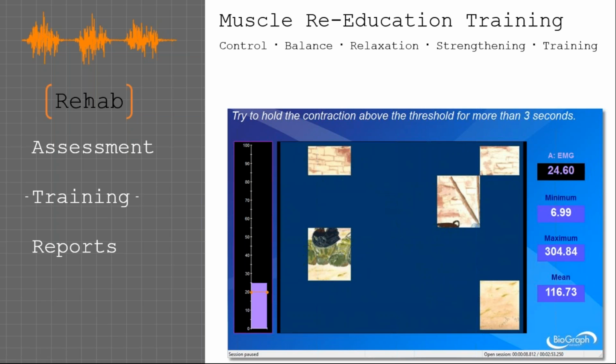Sometimes it's going to be sound, sometimes it's going to be visual, but there are animations, there are different ways we can tweak the system to better fit and better engage the client. So the feedback is really real-time feedback, so that they attach some sort of thought about what's going on to the feelings that they're having. And the second part of it is so they stay engaged constantly.